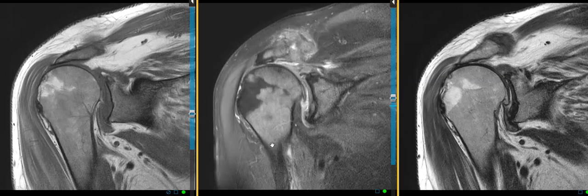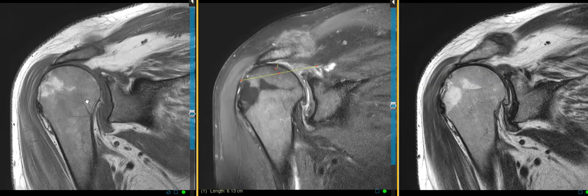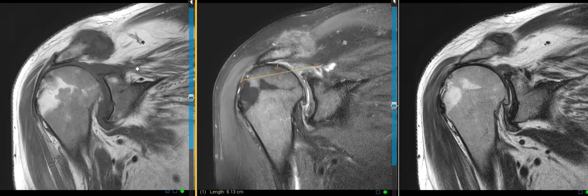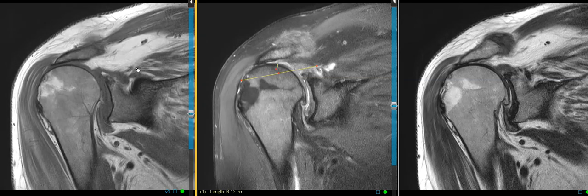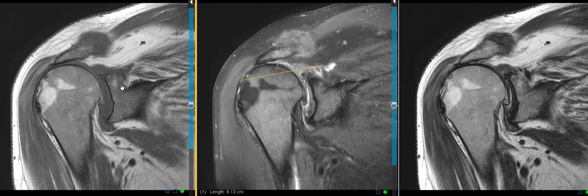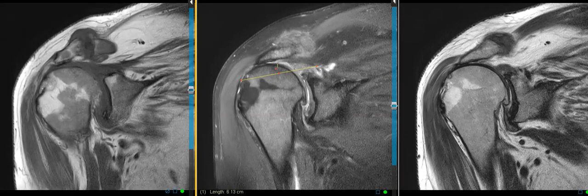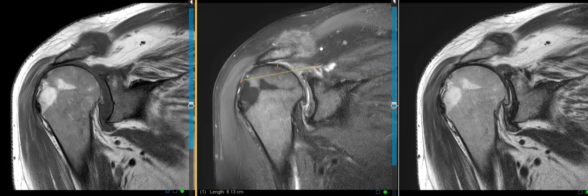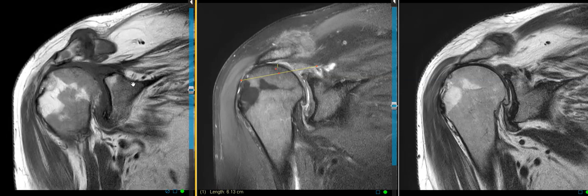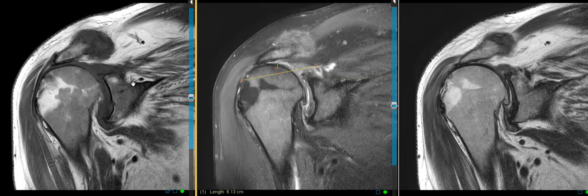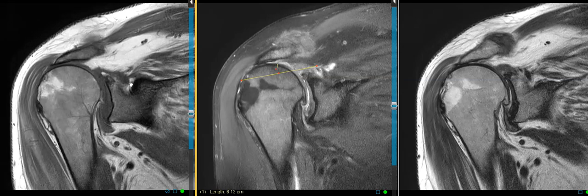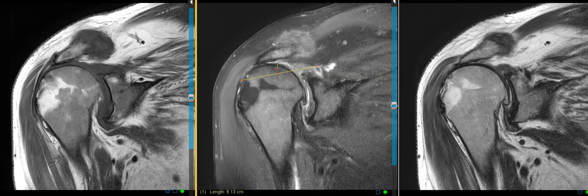Smokers can have patchy marrow — usually not quite this diffuse, but you can have really bizarre marrow appearances in smokers from red marrow reconversion. Even obese women sometimes can have red marrow reconversion with unusual marrow patterns. But in this case the patient had leukemia, and the process is just so diffuse and prominent that it's one of the first things we would think about. There is no definitive diagnosis of leukemia on MRI — they always have to do blood work and possibly a marrow biopsy to get to a definitive diagnosis. So all we can do is suggest this abnormality in the differential, and then clinical examination and lab work are needed to really reach a definitive diagnosis. That's it — thank you very much.